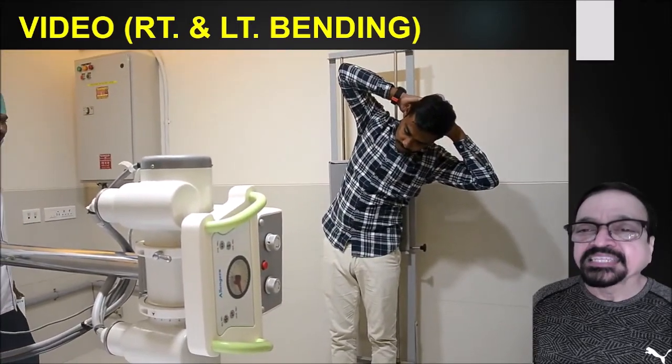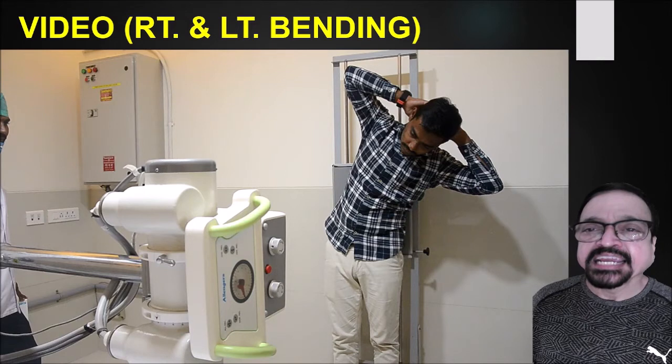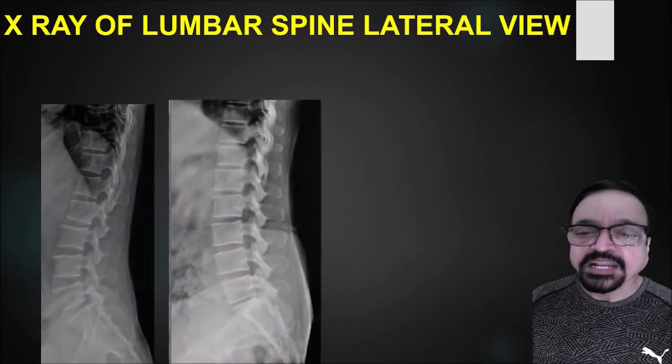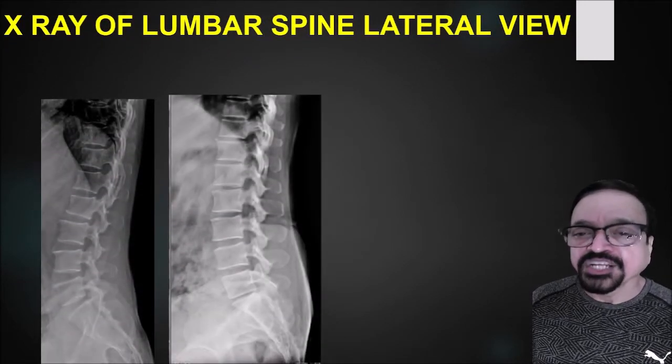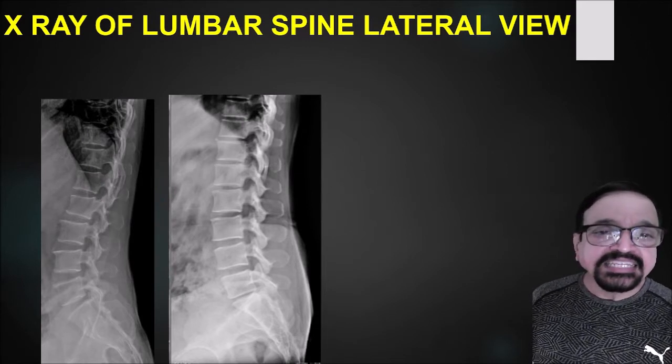All the angles, all the scoliosis workup is done over the standing patient and taken with these three radiographs: straight, lateral bending right side and left side. Now let us come to the lateral projections. Now we are showing you two.